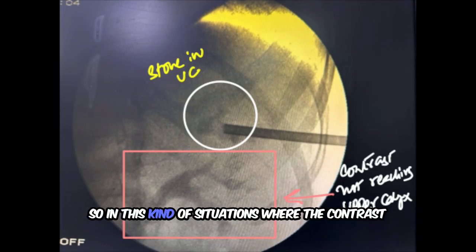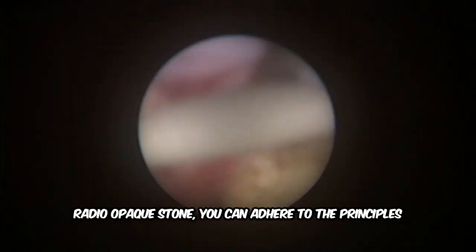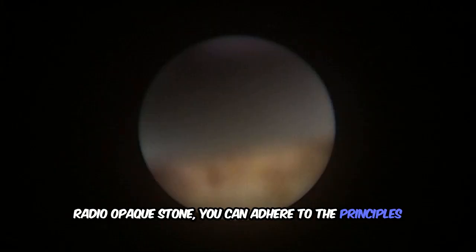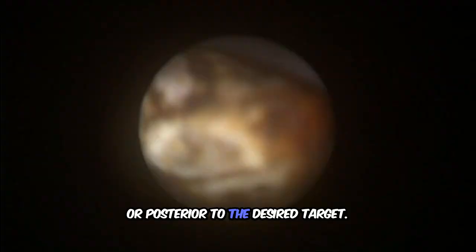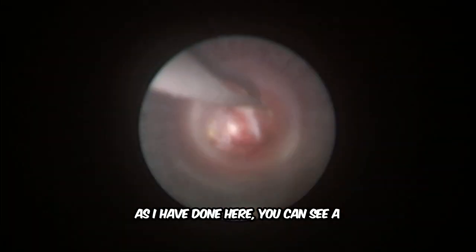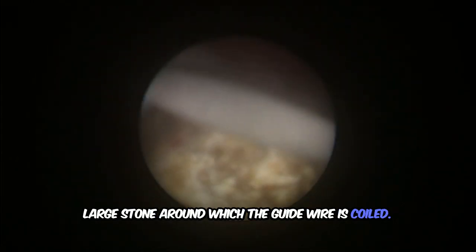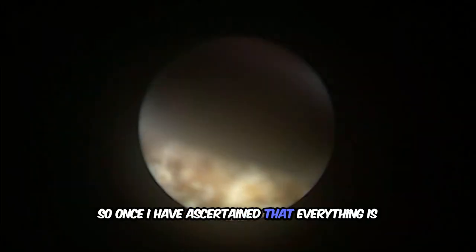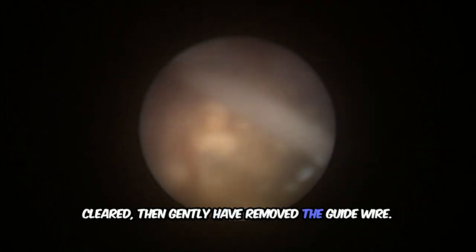So in these kinds of situations where the contrast is not reaching, and if you have a radio-opaque stone, you can adhere to the principles of understanding the C-arm, whether it is anterior or posterior to the desired target, and then you can make a stone-guided puncture as I have done here. You can see a large stone around which the guide wire is coiled. Once I ascertained that everything is cleared, I gently removed the guide wire.